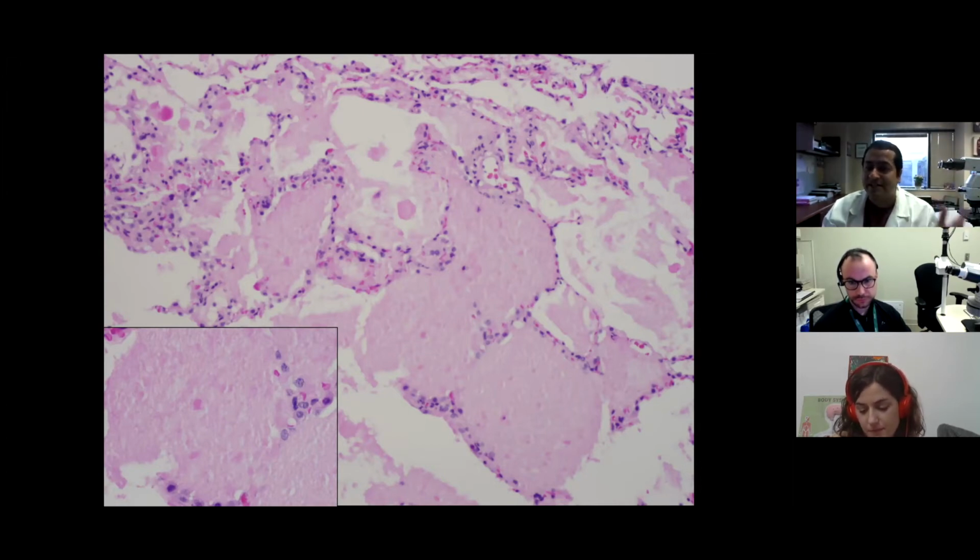And then for pneumocystis, as you saw from what both Matt and Irene presented, pneumocystis causes a froth with dots appearance in the alveoli. The interstitium is generally a little bit abnormal. The type 2 pneumocytes are prominent. In PAP, which is what this is, alveolar proteinosis, the interstitium is absolutely normal, which is fascinating because it looks interstitial on the CT, but on histology the interstitium is absolutely normal and all the abnormalities are in the airspace. And if you really are having difficulty between pneumocystis and alveolar proteinosis, just do a GMS, and the GMS will be negative here. Is that fair, guys?